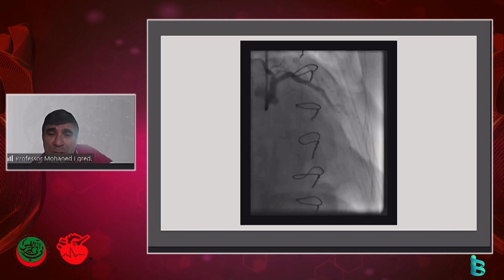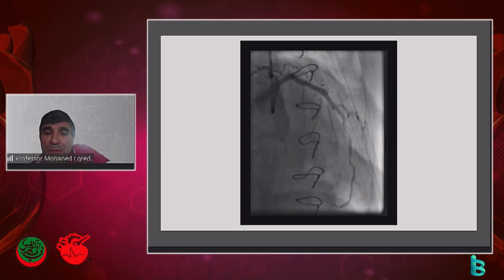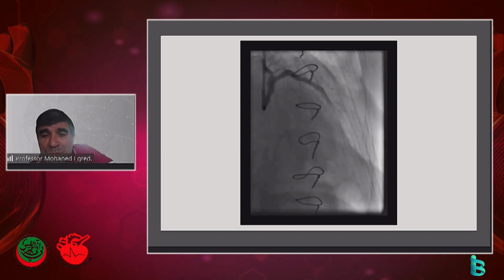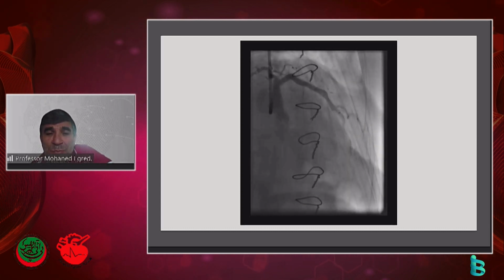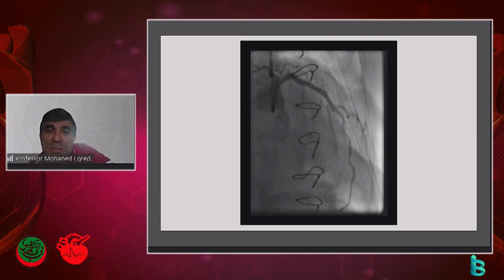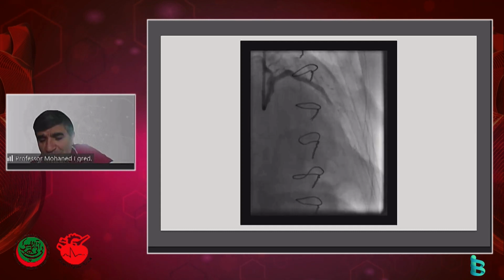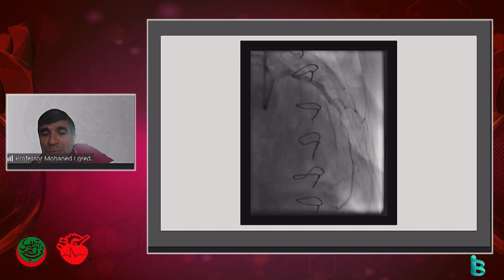So the point here is, if you feel like you need to use any calcium modification equipment, just use it, because quite often you get sucked in and you try to use a balloon and a wire and you spend an hour or two. There was a case, actually, I should have shown this picture. I took it. Somebody was doing a case and it was a resistant lesion. Two hours later and 23 balloons after, the lesion still has not cracked. 23 balloons. So I think you could imagine, taking a rota wire and rotablating the lesion took about 5 minutes, and then everything was finished quickly.